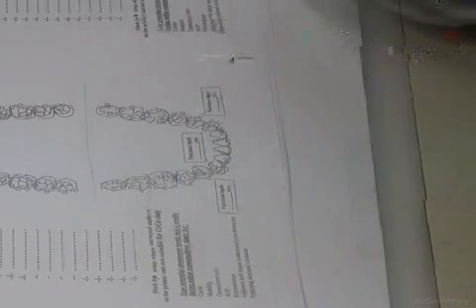Mobility, once more, you're the only person to know where mobility is, so you have to write it down. For example, on this tooth, maybe I have grade 2 or grade 3 mobility, I have to write it down. These findings, you have to put them wherever they are. If you find a low crown to root ratio, I write down, for example, this premolar has a low crown to root ratio. If you have a restoration, on cast you can't see restoration, so you have to write down your restoration on the chart here. And so on. So these are the clinical findings. You are the only person that can find these, and you have to find them from clinical examination.